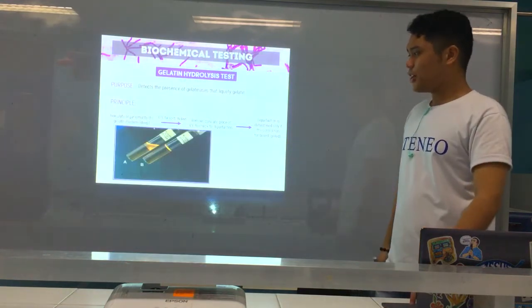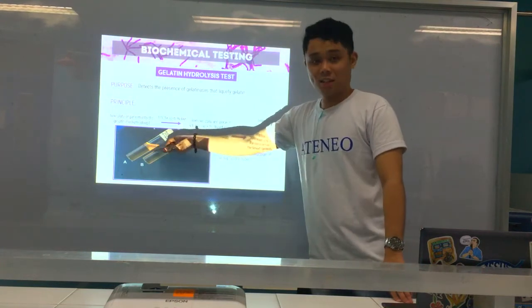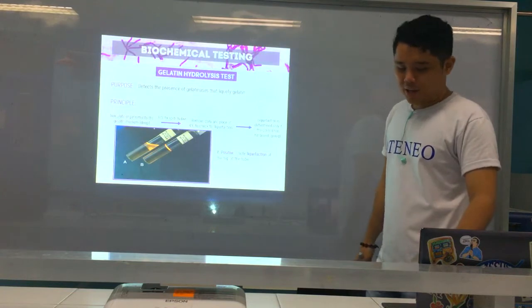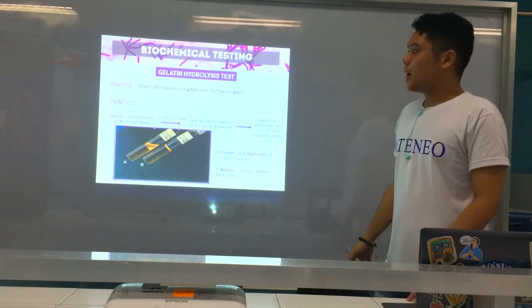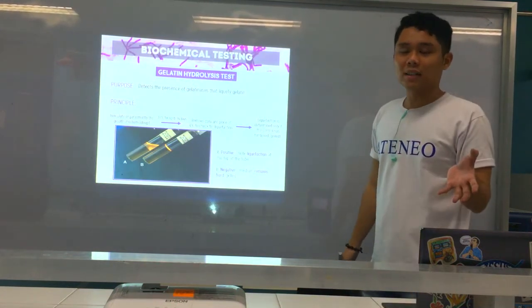Okay. So here's an example. Of course, letter A is positive, liquefaction, meaning it has become liquid. Okay? And for letter B, remember, it has hardened, there's no liquid. So that's negative. Or, this is the control. Okay? Alright. We use this again still for Corynebacterium and other bacteria also.